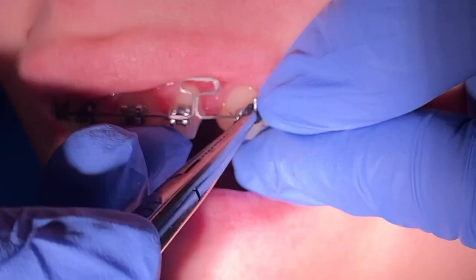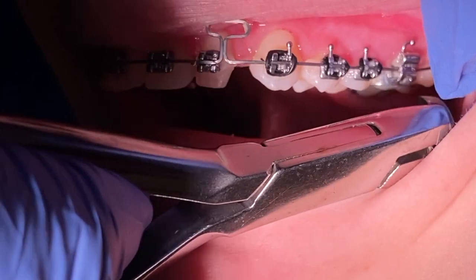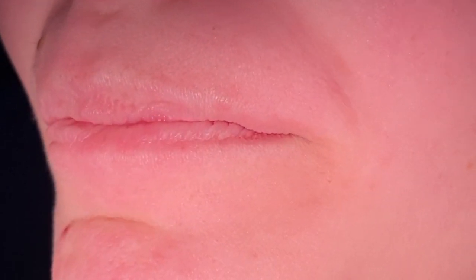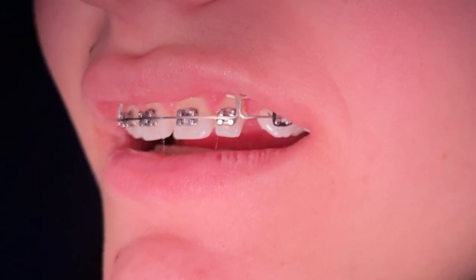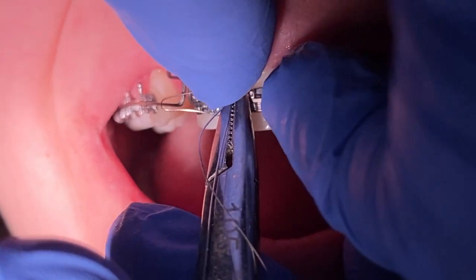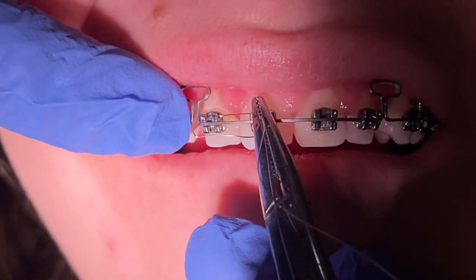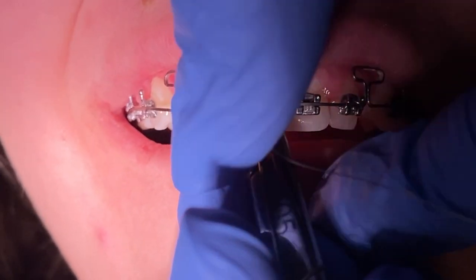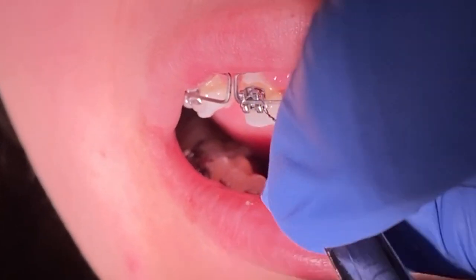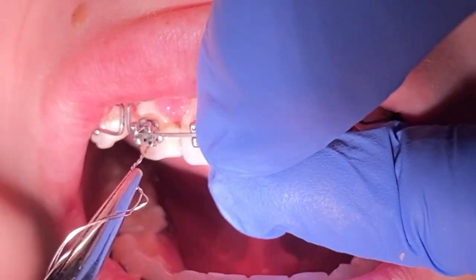You can see that this wire has some hooks. You'll have a lot of ligation ties in place and you're going to have an upper two-to-two chain — a power chain going from your upper left lateral to your upper right lateral. All of this is going to cause a lot of food impaction, food debris, calculus buildup, and plaque buildup. Remember, you have to be diligent in using those home care recommended products. That water pick is crucial when you are in braces, as sometimes the toothbrush can't get around those brackets or grooves — the water pick will flush all that debris out.